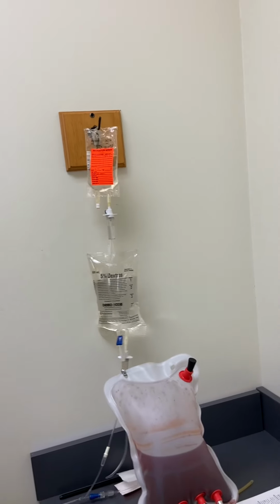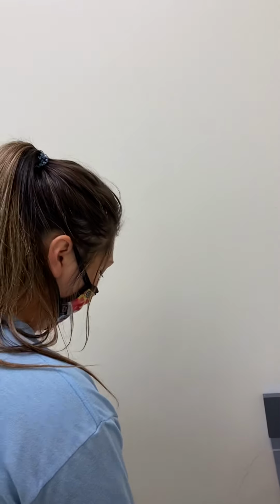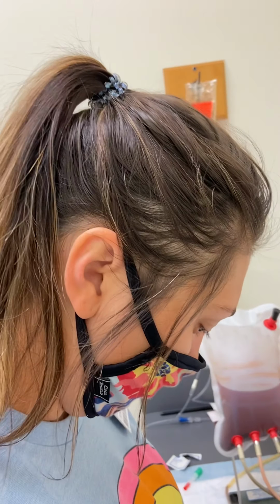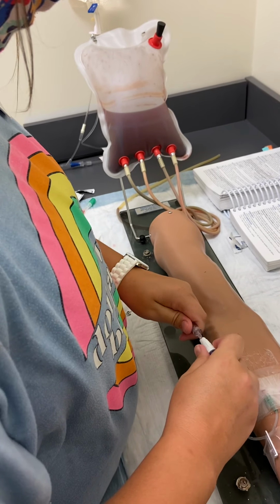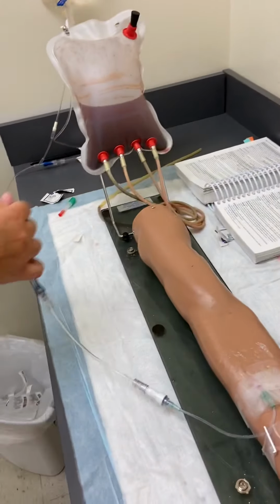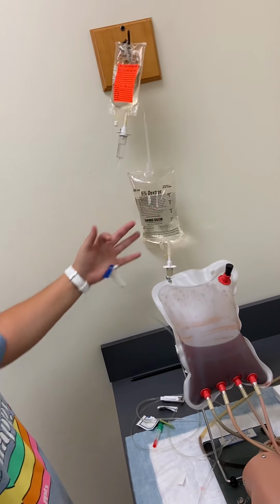Okay, so after all that, I would let it go for an hour, and I would continue to monitor Mr. Smith, and then when I come back, let me put this back up. So when I'm coming back in, I'm going to keep the regular going. So I'm just disconnecting this.